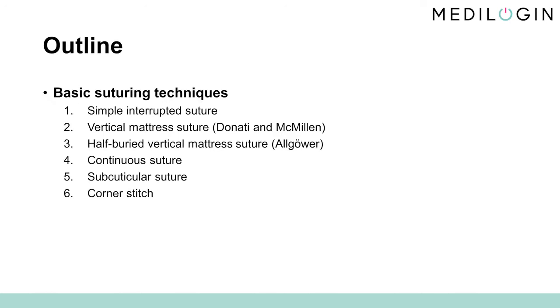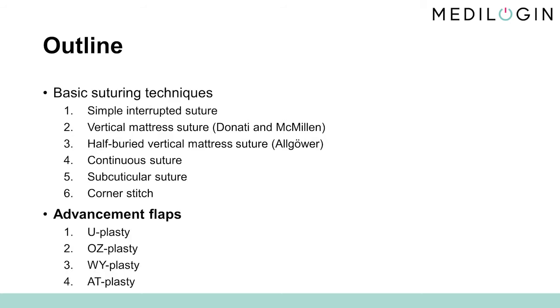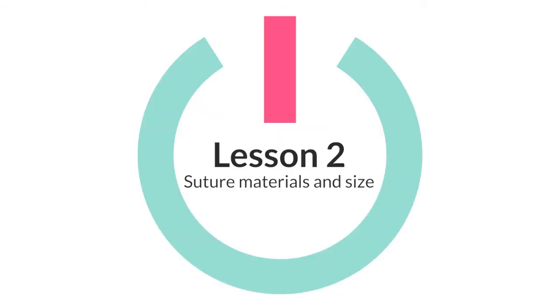We will explain the basic suturing techniques listed here in detail and show them to you step by step using memorable video lessons. When it comes to flaps, this basic course is dedicated to the most important techniques and shows you how to perform them correctly from start to finish in detail. Let's get started.